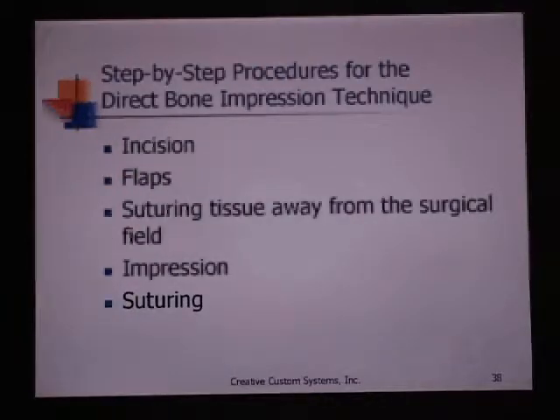Step-by-step procedures for the direct bone impression technique. Incision, flaps, suturing tissue away from the surgical field, impression, suturing.